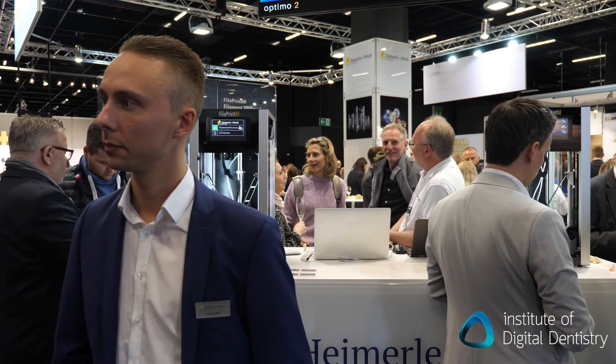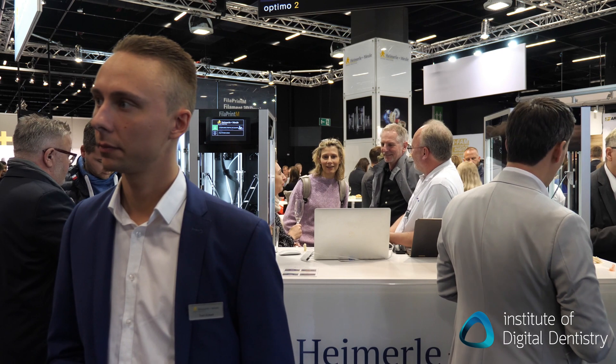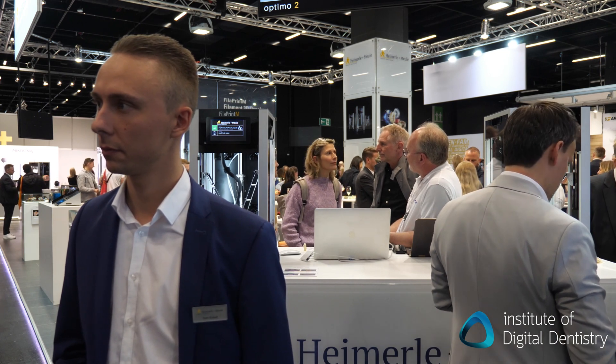First you print the partial denture, then you print the teeth, and then you can put them together with cold cure polymer. So you bond them together, but you can set it up to print both with white and pink loaded in the machine at the same time. Yeah, sure. You have the continuous print, so you have the partial denture, then the tooth, and after the time you come back and you have both already printed. Similarly, if doing trays, you can have the white model material loaded and rotate between trays and models on the same machine.